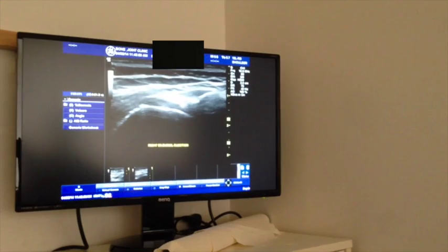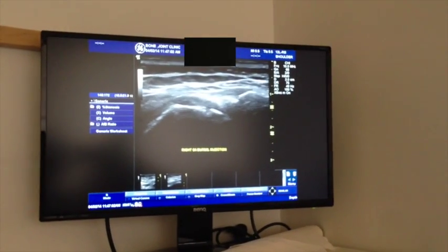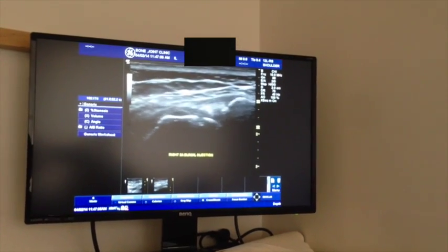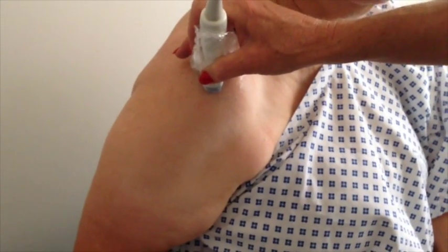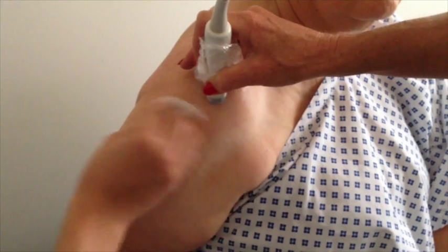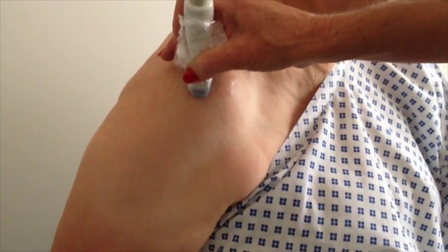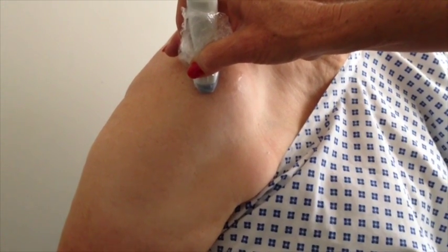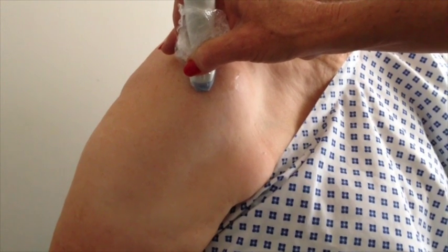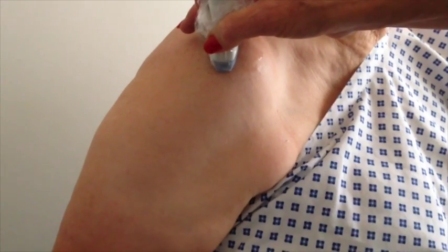And what I'm going to do now is to clean around your shoulder because Lisa is just going to stay very still. Clean around the shoulder. I've already preloaded a syringe with a bit of cortisone and anesthetic to make it more comfortable. Lisa is going to hold still now. I'm just popping on our gloves. I have a very small 23-gauge needle, and we're going to go into that space in a moment.